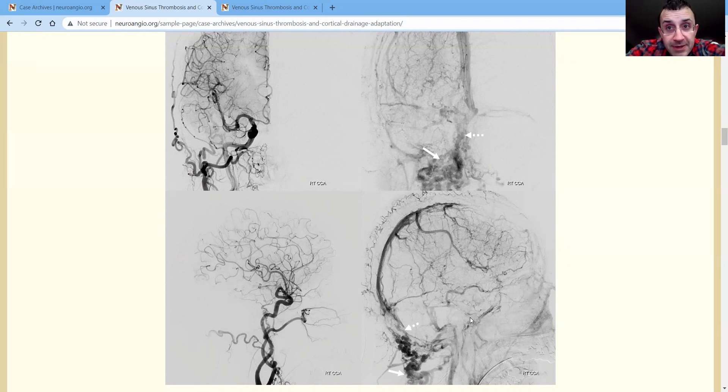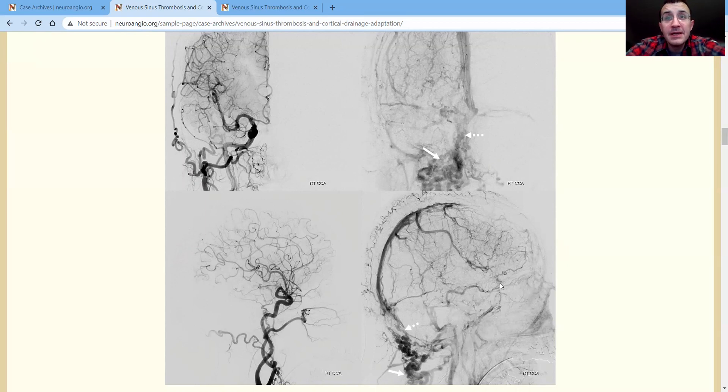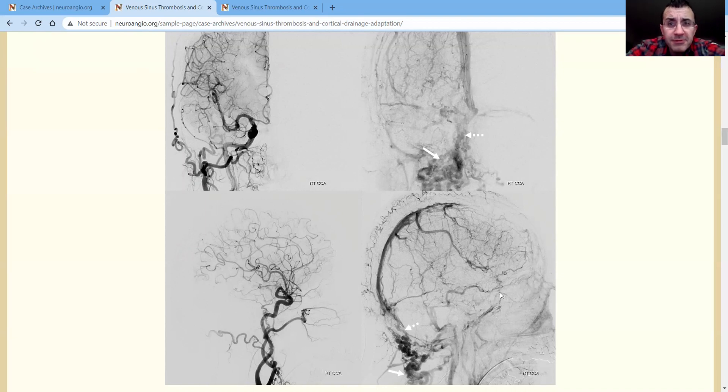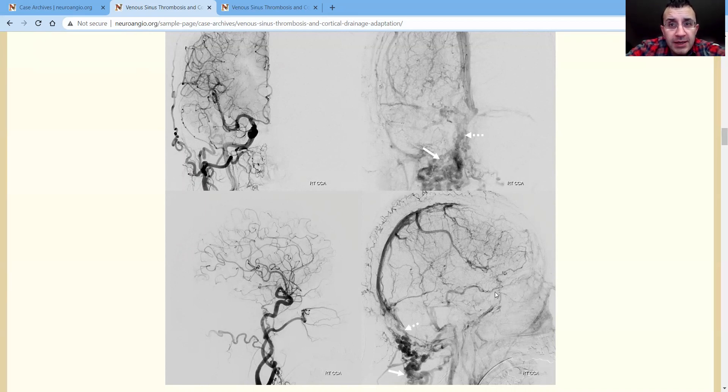Now when the superficial sylvian veins are hypoplastic developmentally, something else—there's always a balance. This whole notion of venous balance is key. If the superficial ones are hypoplastic, usually the deep ones are bigger. And so what do we see? We see this vein.